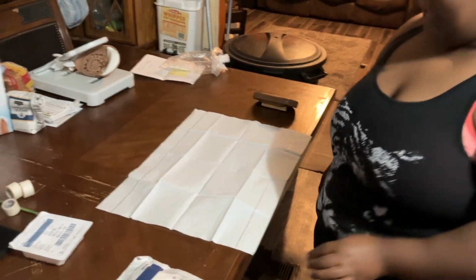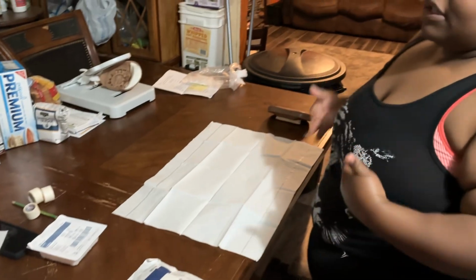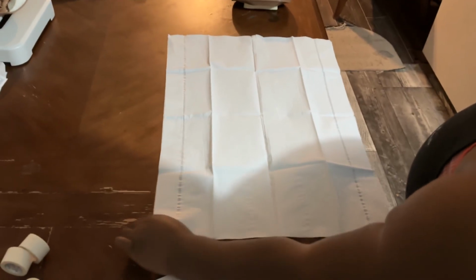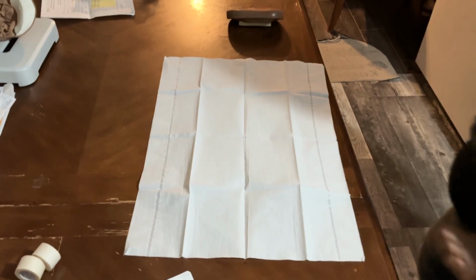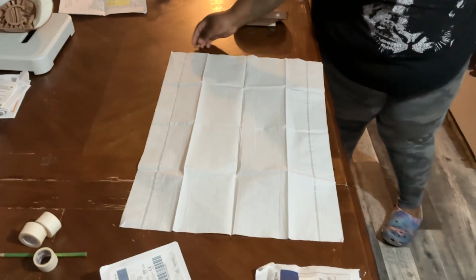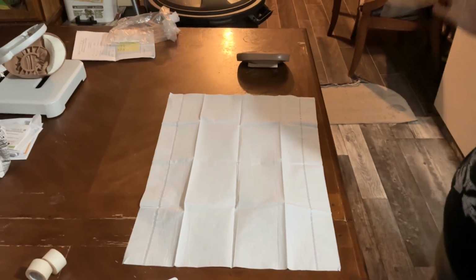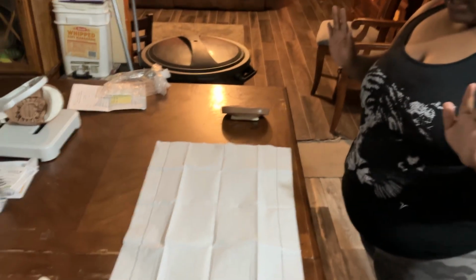I would have a bedside table. It would not be this low. It's kind of difficult to reach down when it's this low, but I'm going to be careful and touch my 1-inch border to fix my sterile field. I'm not going to reach over. I'm going to come to the side. I would not reach over my patient in the real world. I'm going to make sure I maintain sterility.